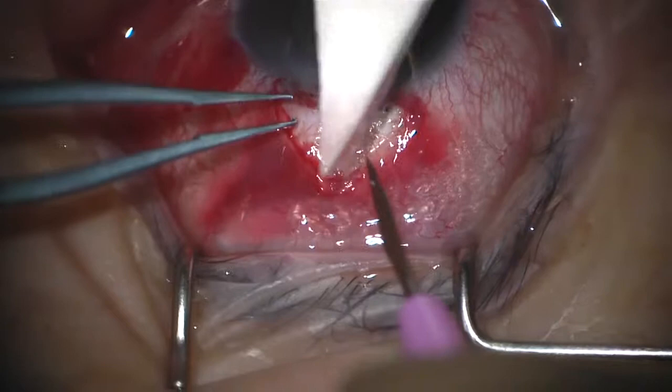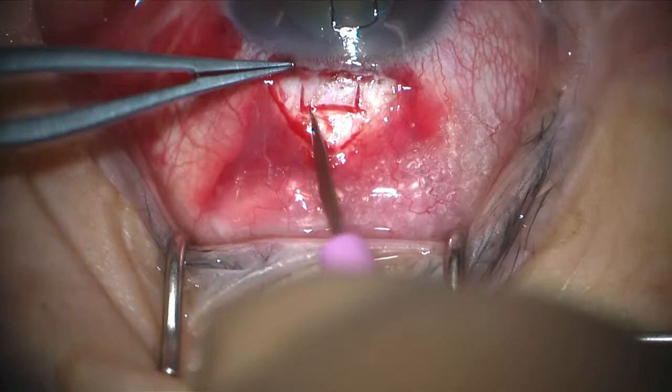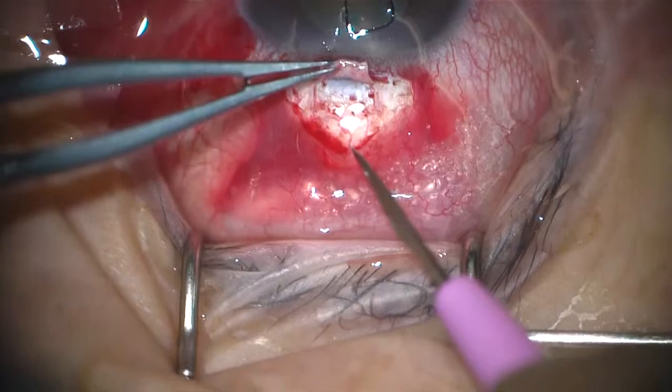When I make the radial incisions again, we're not going to go right up to the limbus because we don't want anterior drainage. So you can see that's quite a nice thick flap. Ideally we need a thick flap, and we're into clear cornea, so we know we're far enough forward.